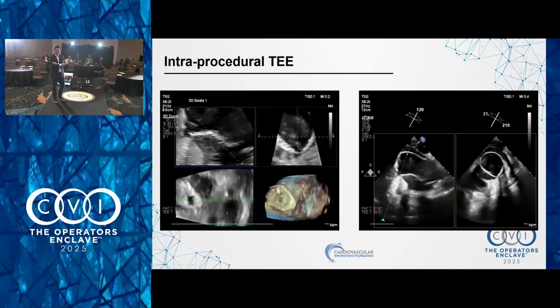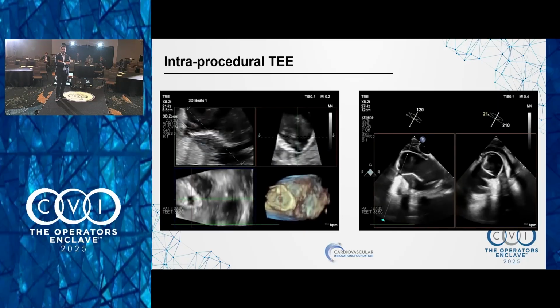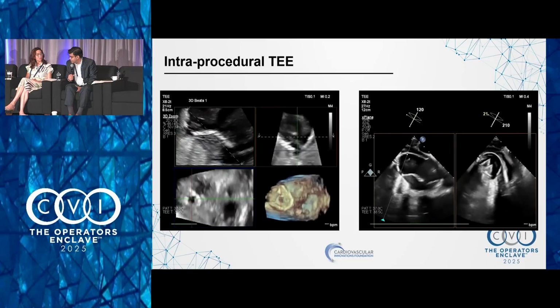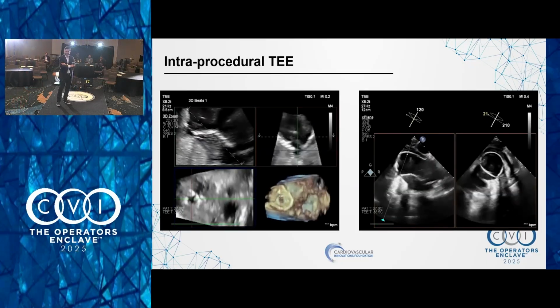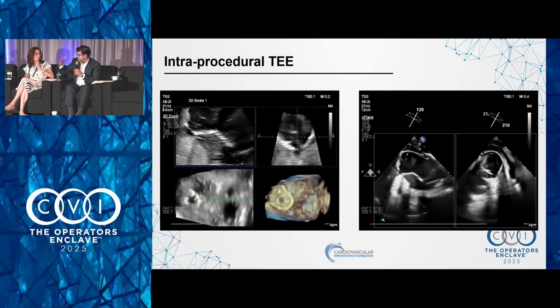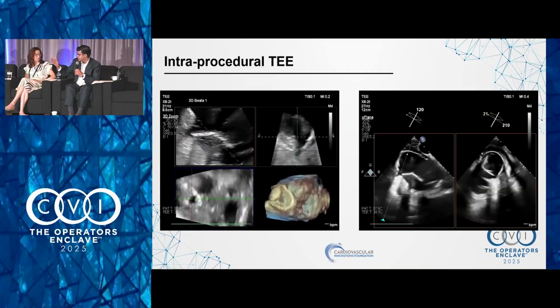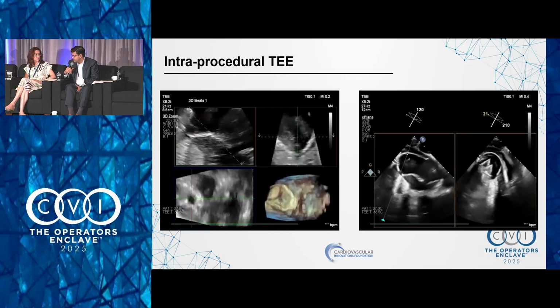I would have a stent ready in the RCA, and then I would do an AVP, just have the disc of the AVP out, and then basically just jam it into it with the stent hanging out a little bit. Overinflate the stent and crush the AVP? No, not crush. Basically it has to cover the part of the disc, so it doesn't pop out later or move or come back into the coronary, because we don't want a coronary infarct later on as well.